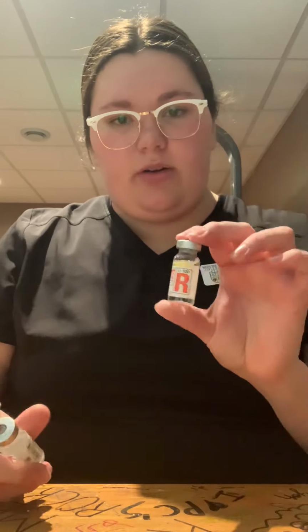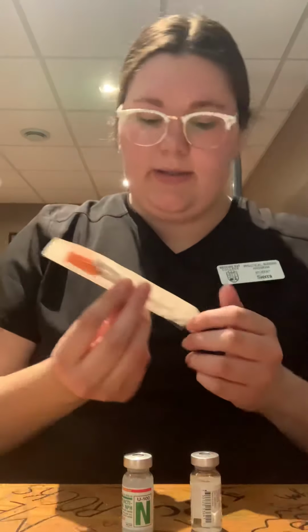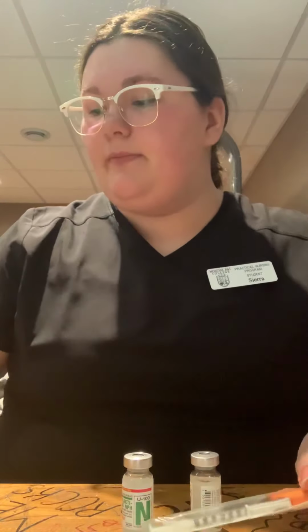So when preparing insulin, you want to make sure you have the right stuff. For this one, we're going to be doing Humulin R and Humulin N. You're going to be needing your insulin needle, alcohol swabs, and then I'll be injecting into an orange.